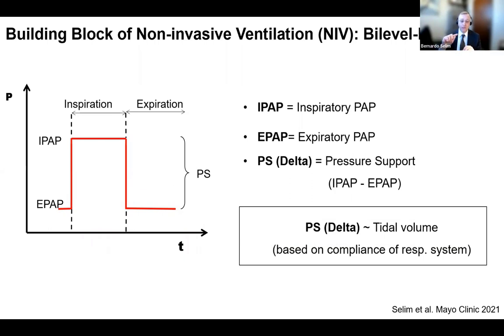And not all DMEs will have respiratory therapists to help translate your prescription to the settings of the device that they have. And you may need to understand very well the difference between IPAP and pressure support and how you can translate one to the other. Concept number two, regarding the pressure support or delta.